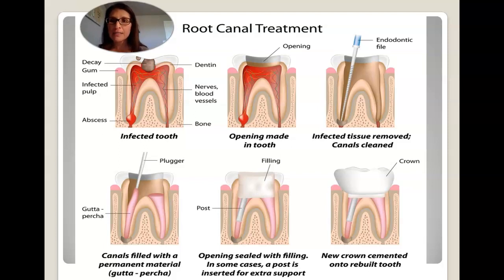I know in my office, I worked for a general dentist, and we did our root canals typically in 2 appointments. First appointment consisted of opening up the tooth, cleaning it out, getting our measurements, putting a temporary in. 1 to 2 weeks later, we'd bring the patient back. We'd make sure that the canals were cleaned out, and we'd seal it up or complete it.